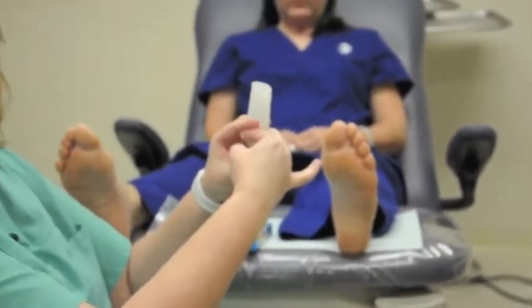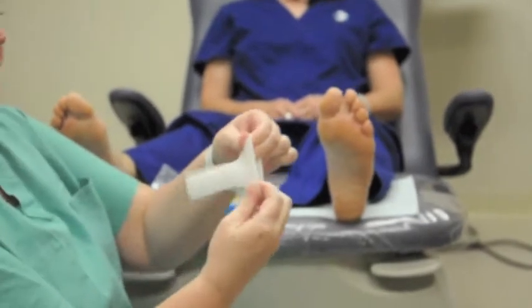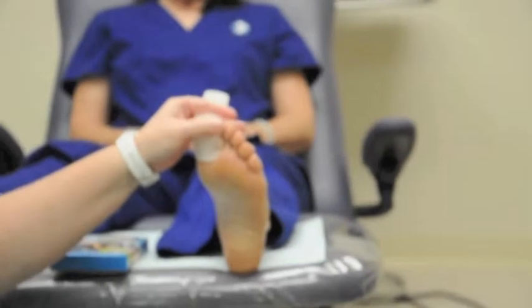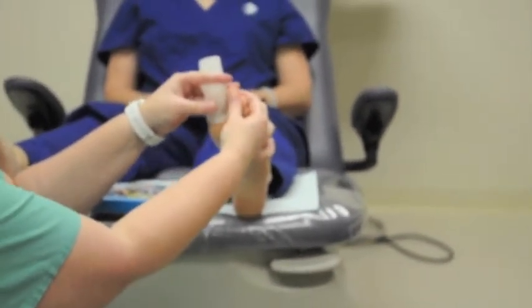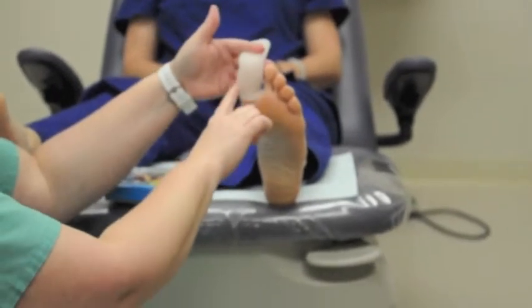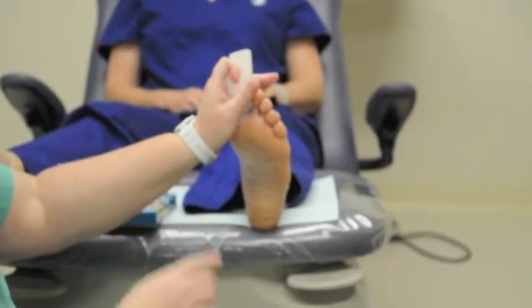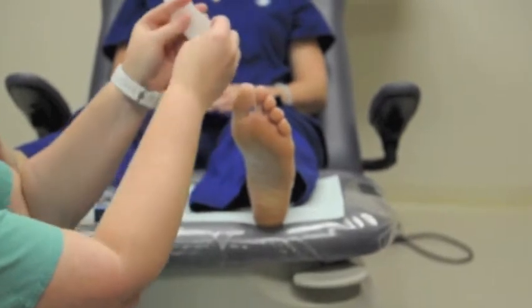You're going to cut this and then all you do is wrap it — it's very elastic. You wrap it over the toe like that and what it does is it keeps pressure off the toe. If you've got a corn in between the toes and they're rubbing, this keeps pressure off of that. If you've got some sort of bony prominence rubbing against the shoe, it'll take the pressure off. All this is is to take the pressure away and prevent the toes from rubbing together.